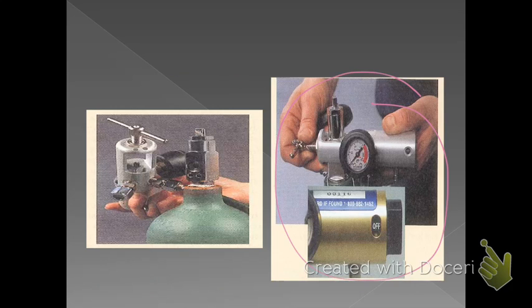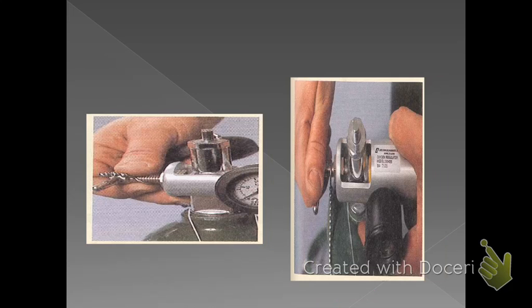So tighten the pressure regulator up, make sure that it's off. So we're going to tighten the pressure regulator. And then in our next step, again, we're just continuing to tighten that pressure regulator. And so these are just different angles. Again, tighten the pressure regulator. If you do not tighten the pressure regulator, it will fly off when you turn it on. So you want to make sure there is a good seal between the pressure regulator itself and the actual oxygen cylinder.